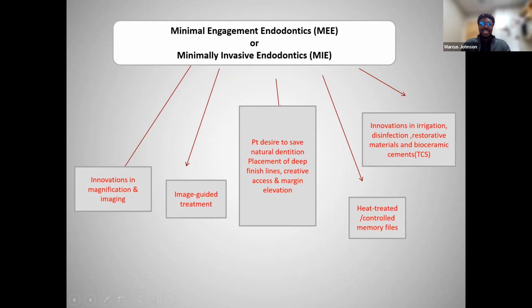And so we've seen new developments and innovations in magnification and imaging. I think I'll show some photos of me working through the microscope. CBCT is an everyday staple within my practice. I don't use that on every patient. We have an American Association of Endodontists position statement where there are certain cases, maybe like retreatment or challenging anatomy, where it is indicated, but it's not indicated for every case. However, the value in using it on every case can definitely be realized. So I tend to use that more often than not.